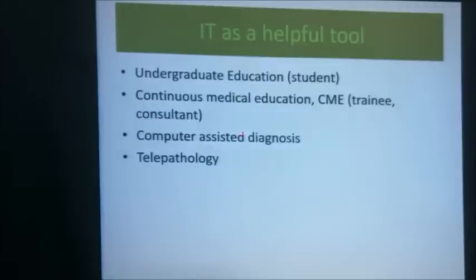And we have something called computer-assisted diagnosis, in which the computer can assess some of the criteria and then will lead you to the final diagnosis in a very accurate way, and we have actually done a big part of this. And telepathology. Tele means remote pathology, so you can ask another one in another country to help you with diagnosis. Or you can diagnose yourself while you are away from the microscope or the slide itself.